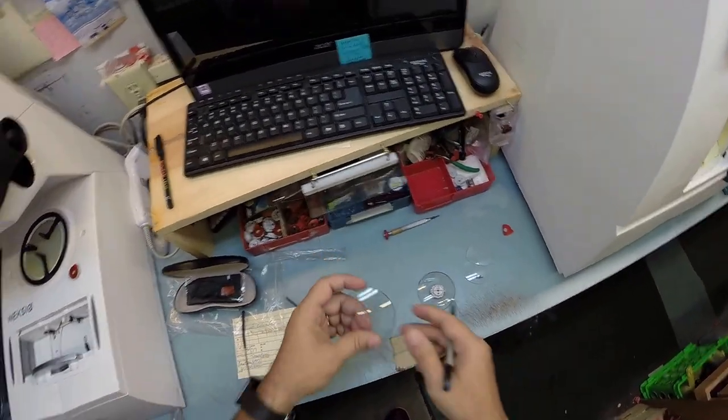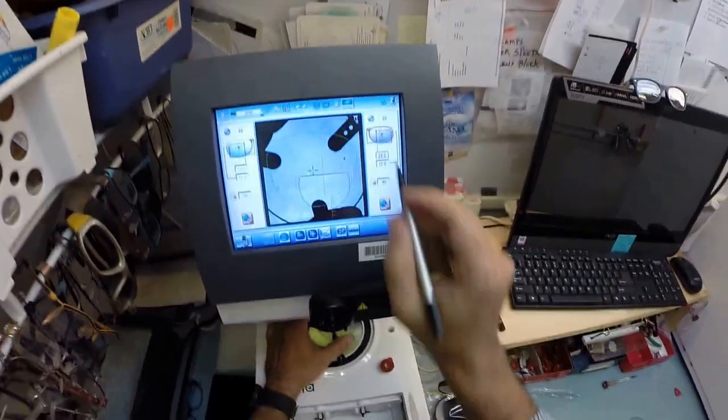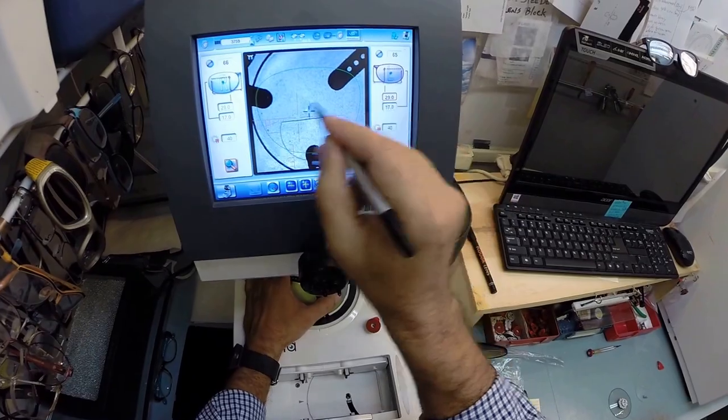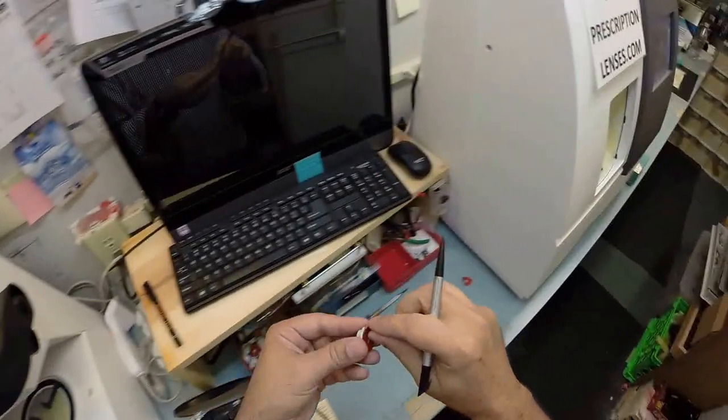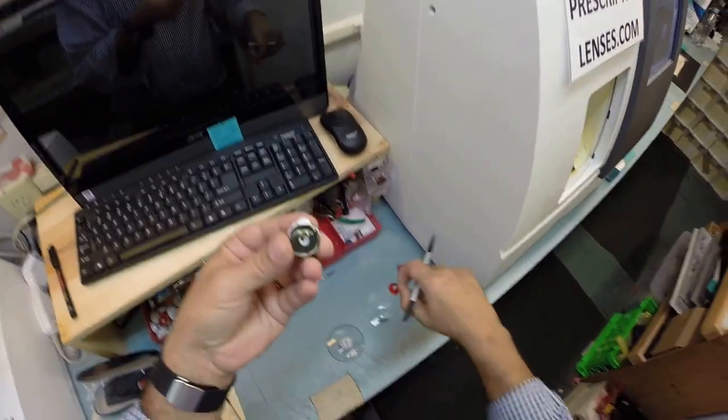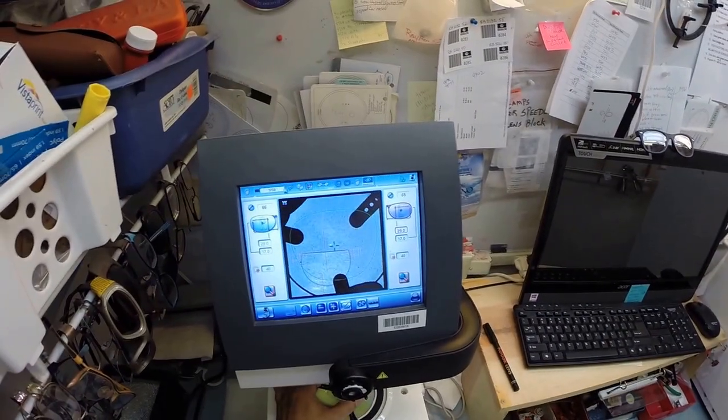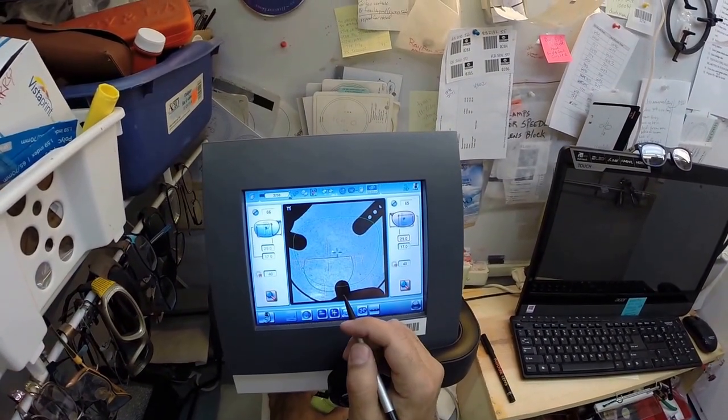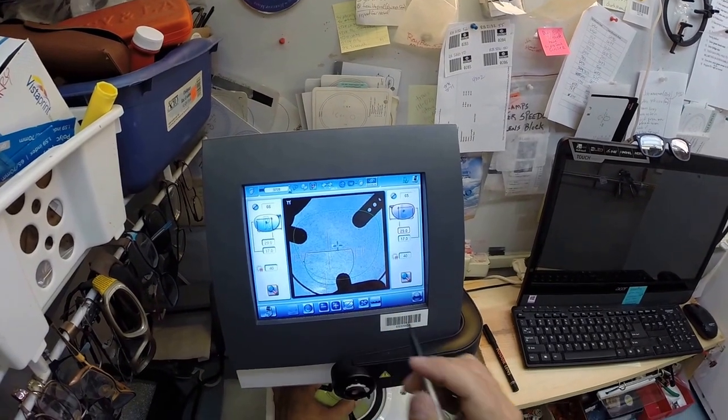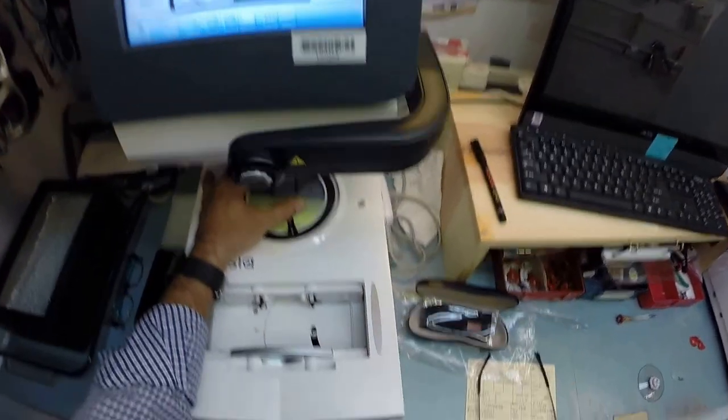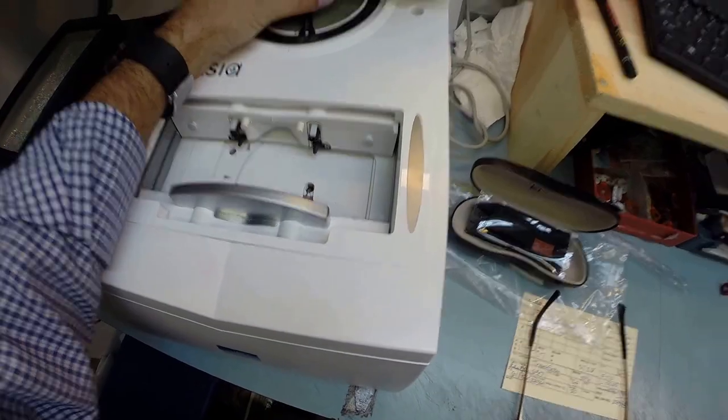We're gonna do the same thing now for the left lens. That's gonna flip over. All the measurements are gonna mirror the right. Let's pull the paper away to make the black side sticky. Line everything up perfectly and put everything inside the grid where it's supposed to go. Hit that button and now the block is gonna come down and be placed onto the left lens.